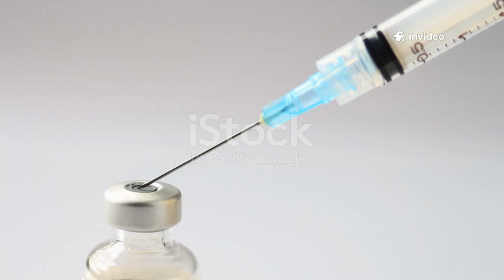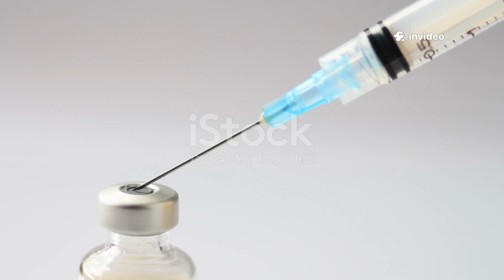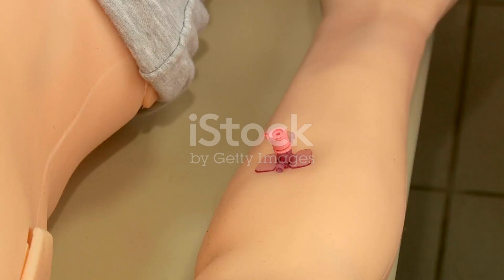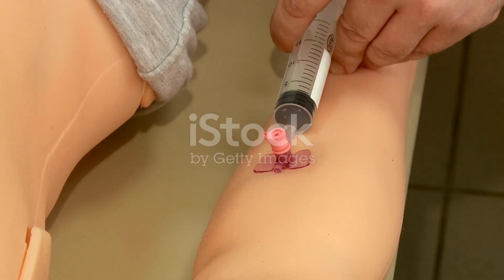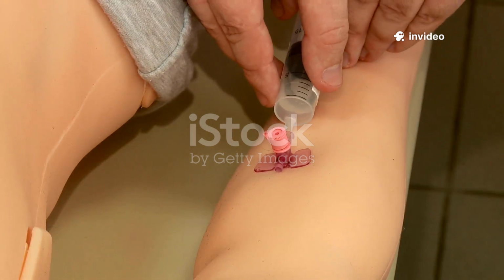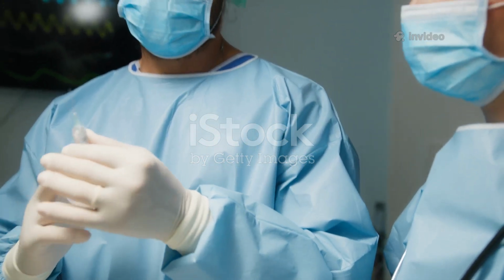Intramuscular injections are used for vaccines, antibiotics, hormones, and vitamin preparations. It is used when oral route is not suitable. Common intramuscular injection sites include deltoid muscle, ventrogluteal muscle, and vastus lateralis muscle. Site selection depends on age, muscle mass, and drug volume.